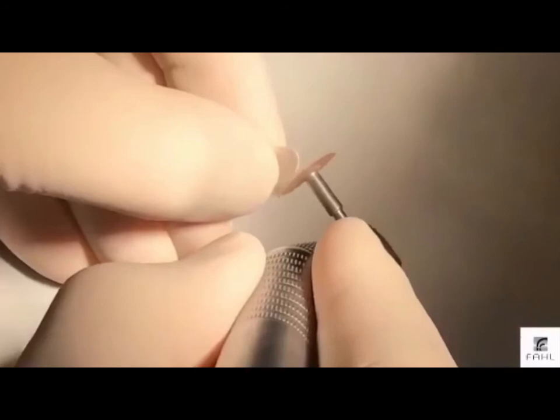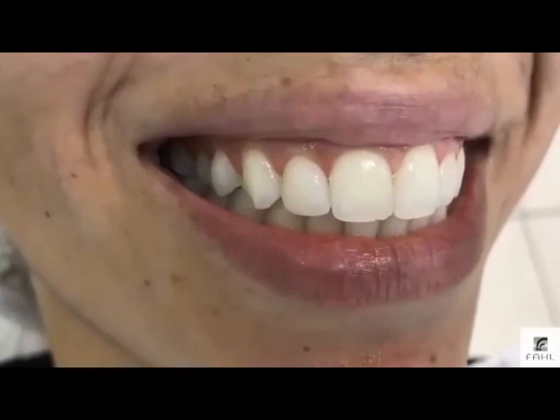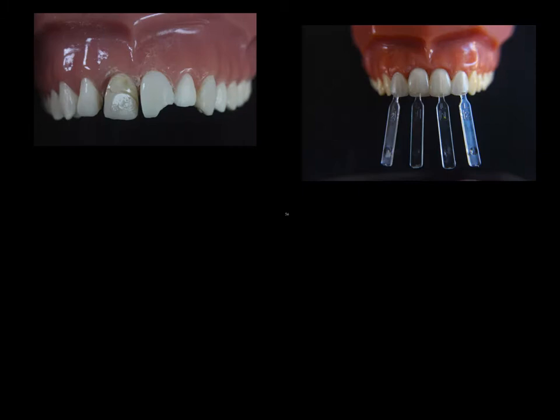Some polishing diamond paste, and you can see before and after. Show the patient, and you can even cement it later with a flowable composite if you want to. So this is an indirect way of creating a mock-up. You can also do it directly, either on the patient or on a model, to show the patient how it looks like a wax-up.